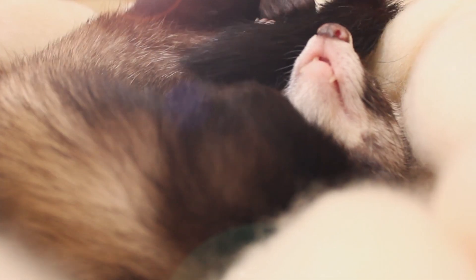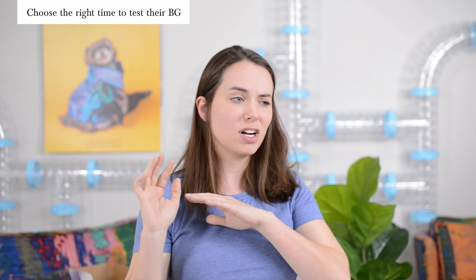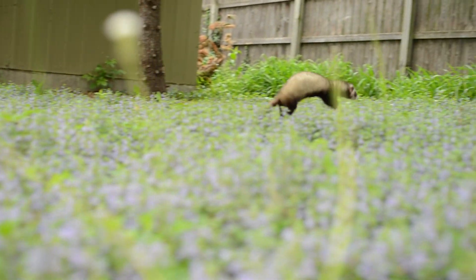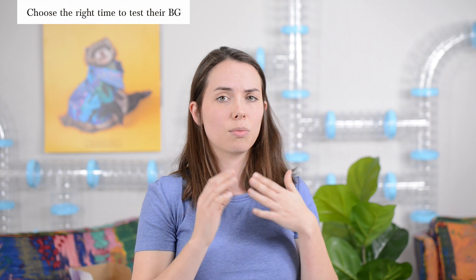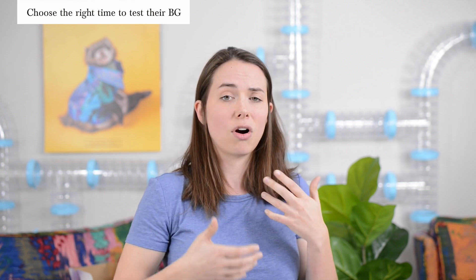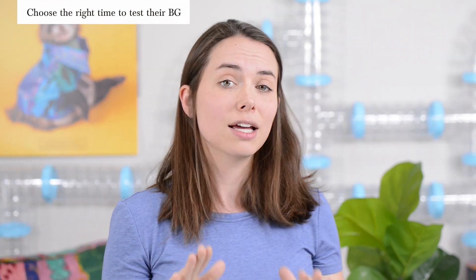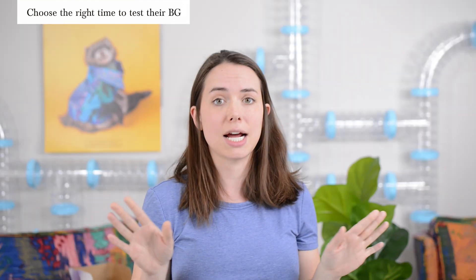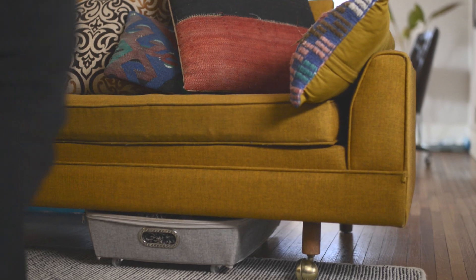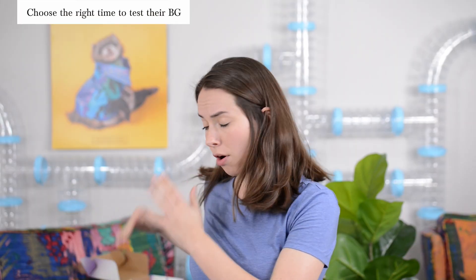Next, grab your ferret. We like to test blood glucose levels after they wake up in the morning. A non-ideal time is when your ferret is running around playing — they won't want to sit still. Don't test right after they eat because levels could be artificially elevated, and do not give your ferret a sugary treat before testing as it will completely inflate the numbers. Ideally wait three to four hours since they've last eaten. Then put your ferret in your lap with all your equipment ready to go.